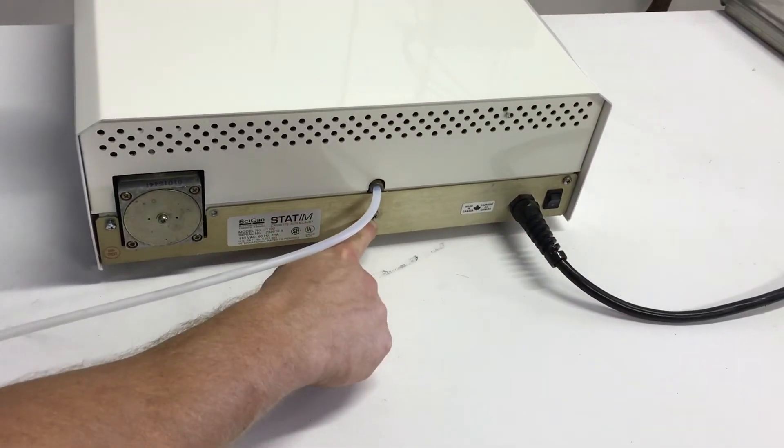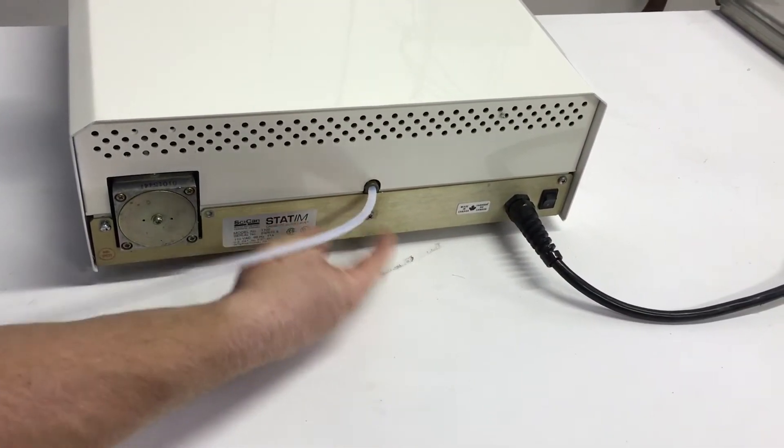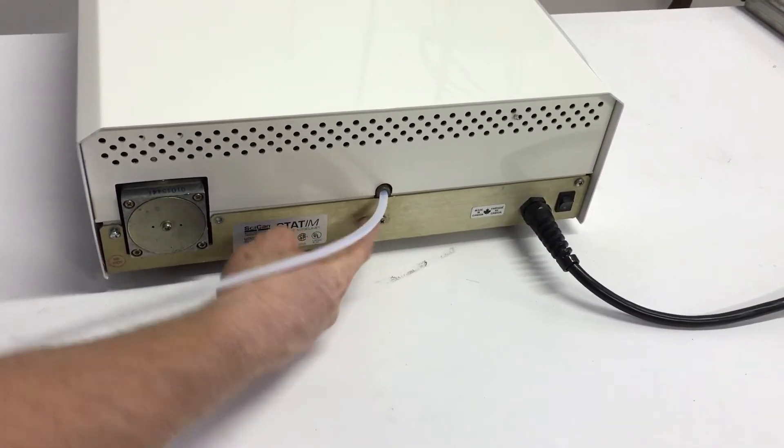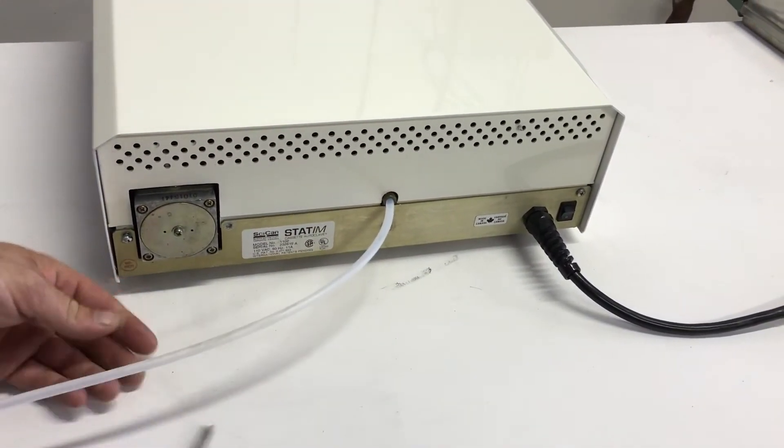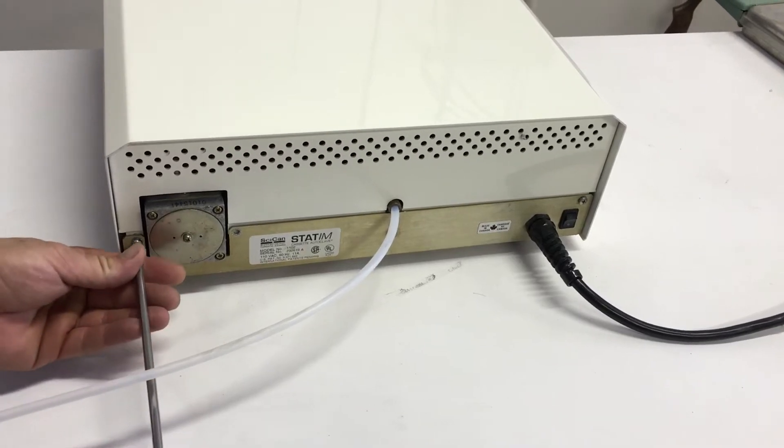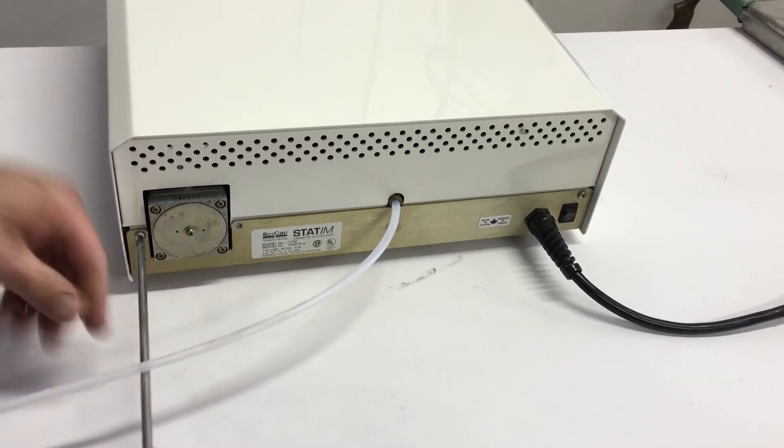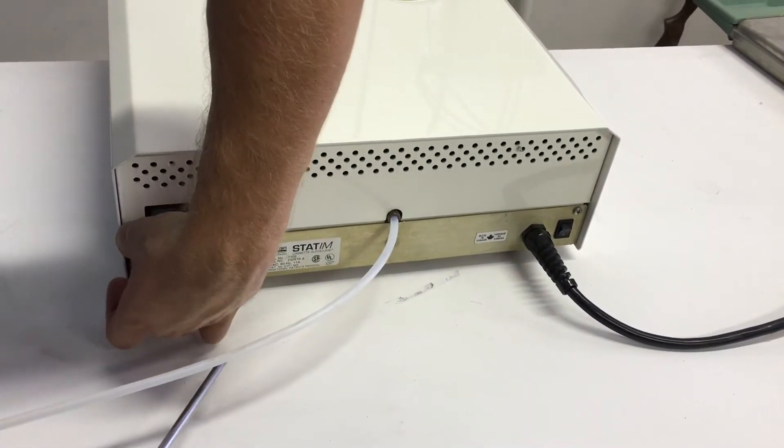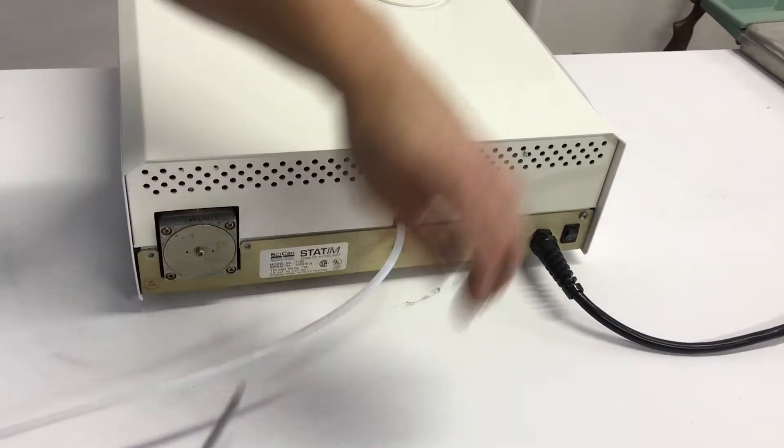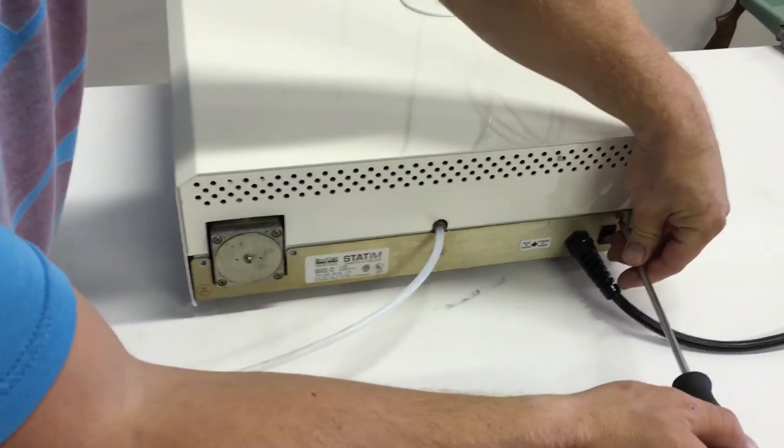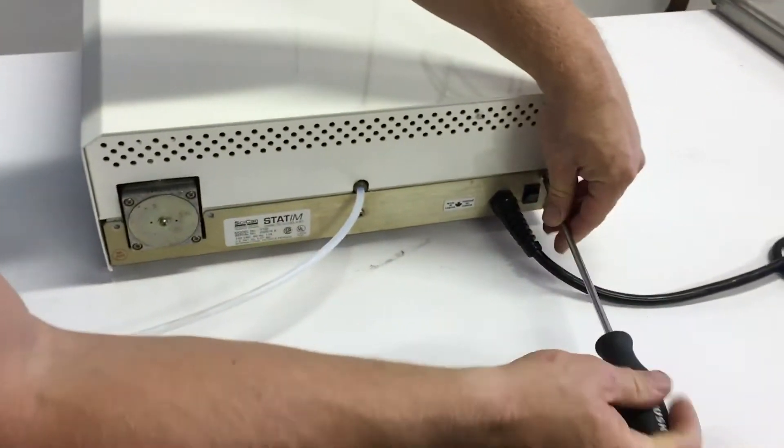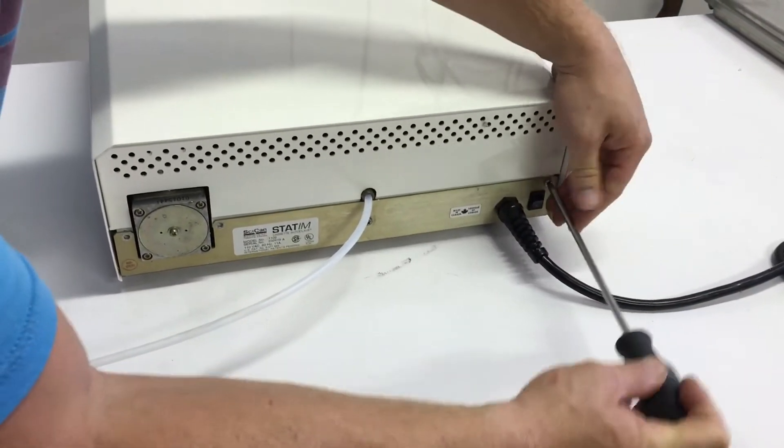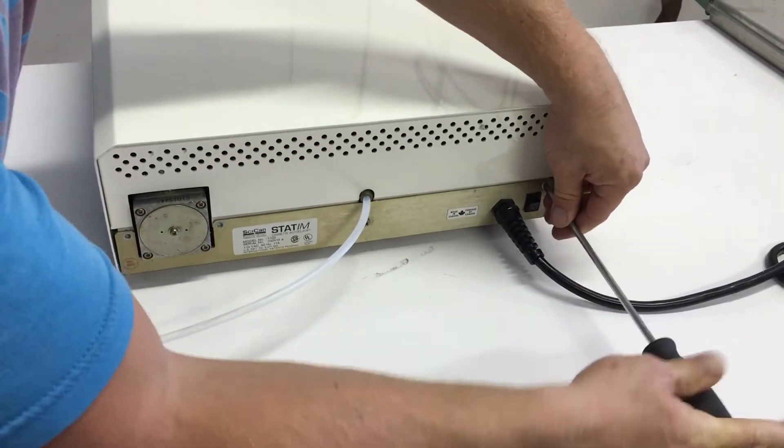Do not unscrew this one. Repeat, do not unscrew that one. Anyways, you're going to unscrew them, make sure that the power is off. Set them aside, don't lose them, so that we can screw them back in.